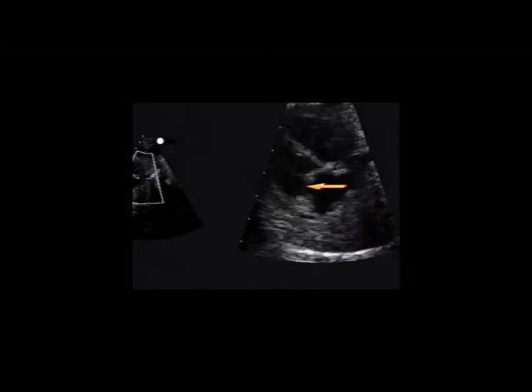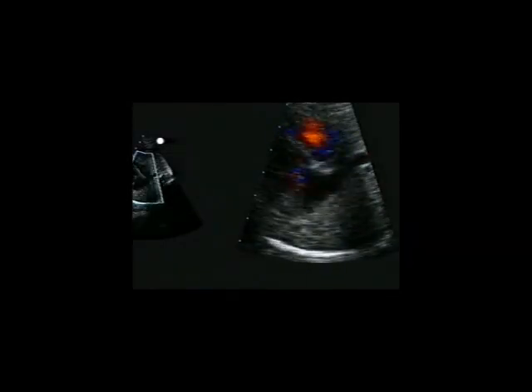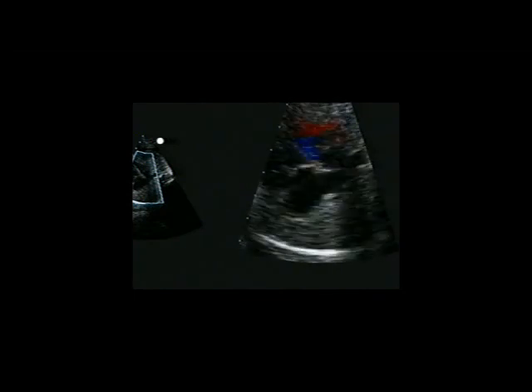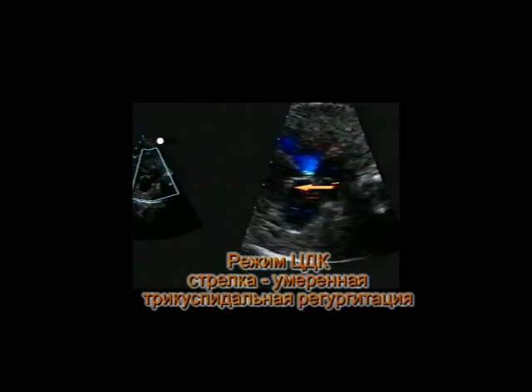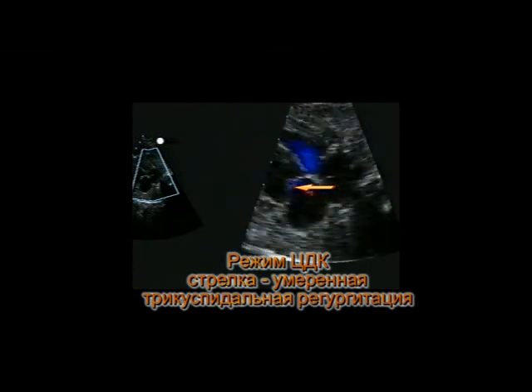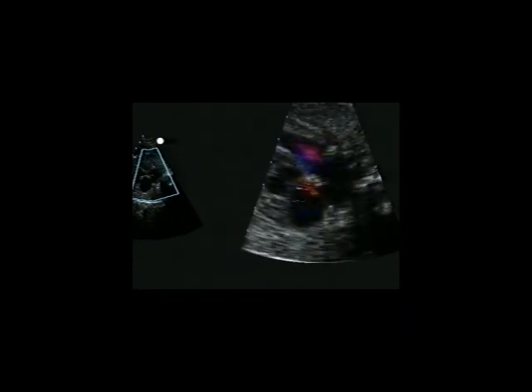В данной позиции более отчётливо определяется снижение амплитуды движения створок трёхстворчатого клапана. В режиме цветового допплеровского картирования отчётливо определяется умеренная трикуспидальная регургитация. Трикуспидальную регургитацию также можно наблюдать в режиме импульсно-волнового допплеровского режима.